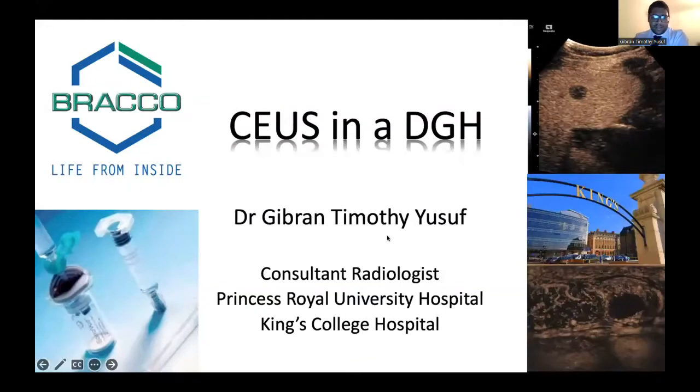Thank you very much for the introduction, Adrian. Thank you for the invite to the seminar. As I said, I'm a consultant radiologist. I work both at King's College Hospital and the Princess Royal University Hospital. One may be one that you've heard of slightly more than the other, but I hope to paint you a picture about the use of contrast enhanced ultrasound in a DGH with a specific focus on the liver setting.